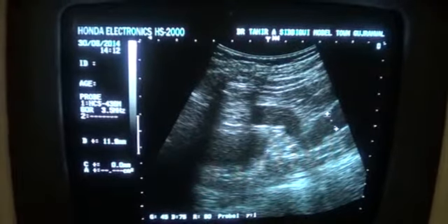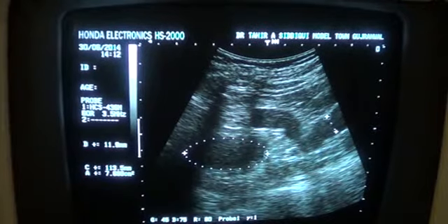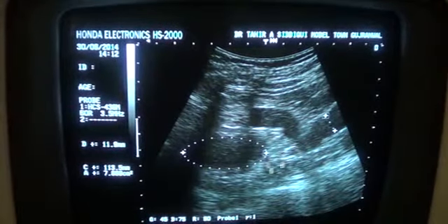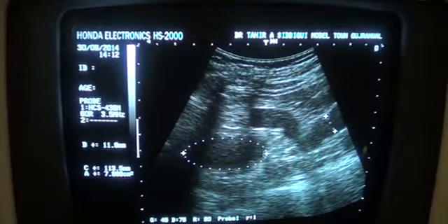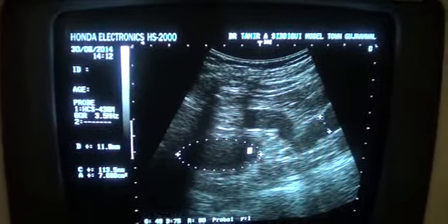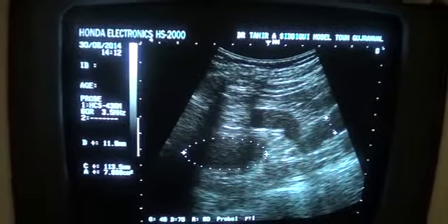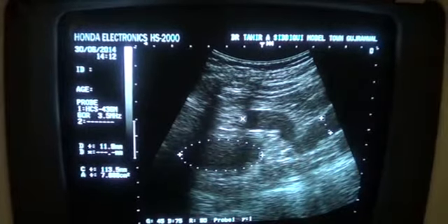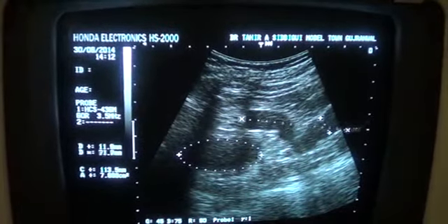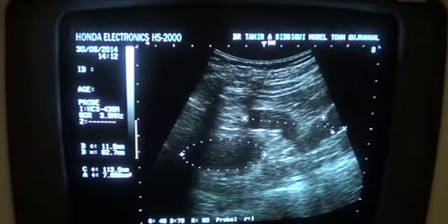Now this being the same structure that I informed you of, this is the iliopsoas muscle. This is the total iliopsoas muscle. The cystic area does not relate to the iliopsoas muscle either. And in this section, the traceable length of the ureter is approximately 6.27 centimeters.